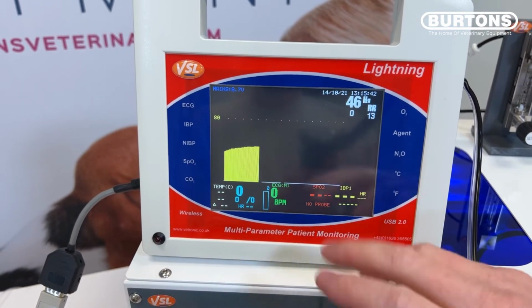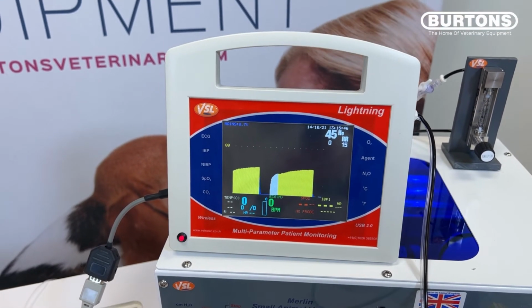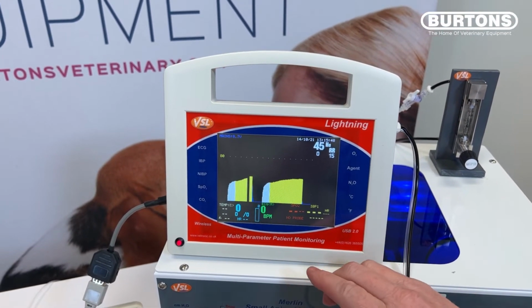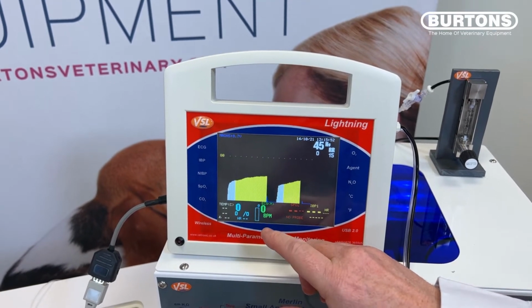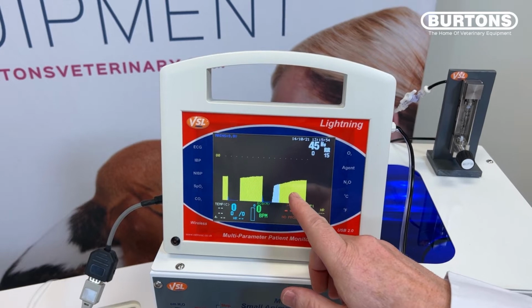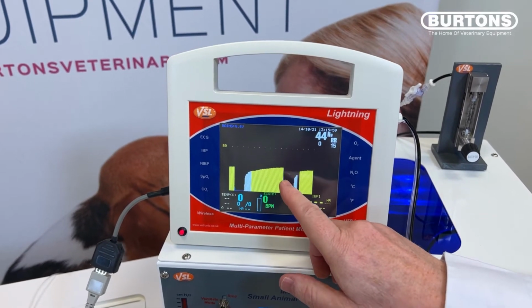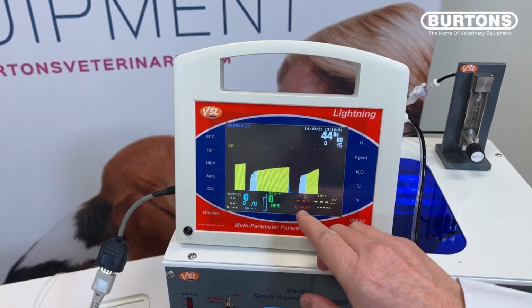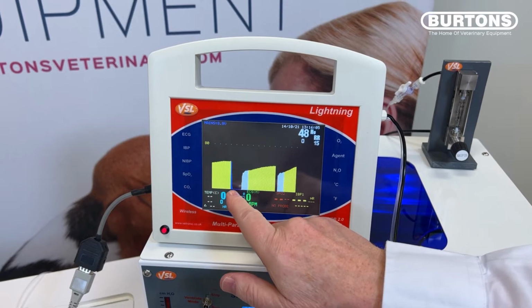Okay, what we now see is a trace that's color-coded as opposed to being a single white trace. Just to explain the color coding, expiration is white, as is the case before. Then the pause is indicated by a yellow coloring of the trace, and then inspiration is indicated by a blue. What we can see here, particularly on this trace, is how thin that blue line is.